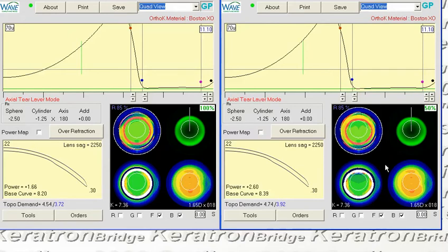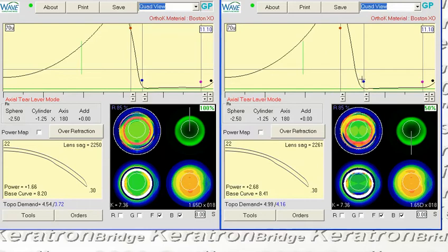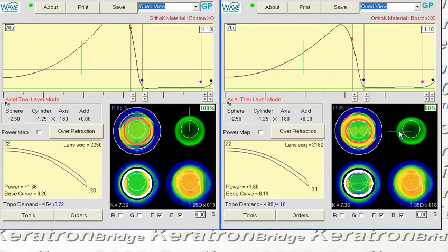Because you're designing in freeform, we need to go down to the bottom and do the same thing. Still in 50%, we're going from 6.5 to 5.9. 7.1 to 6.5. Here in the fluorescein, you can now see that you do have that oval optic zone.